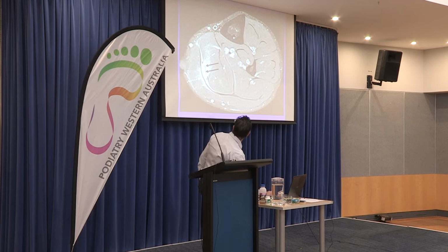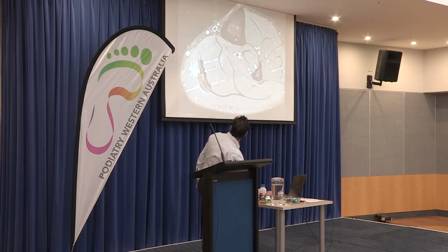So this is a pretty typical appearance. Medial gastrocnemius, lateral soleus here, obviously to orientate yourself, medial side. Myotendinous junctional tear acutely, and most of these guys will do perfectly okay. However, sometimes they don't. And this person then went on, as we see quite frequently, to develop scarring about the myotendinous junction and the aponeurosis.